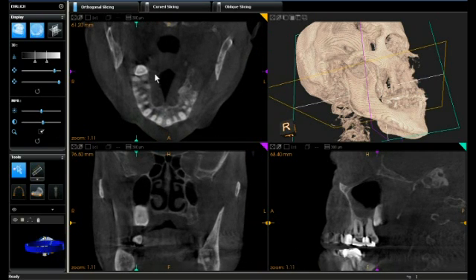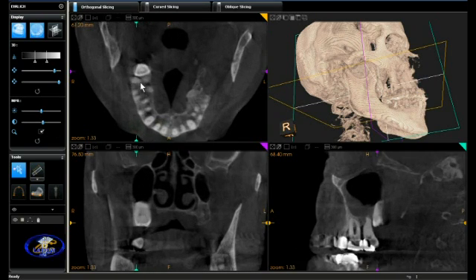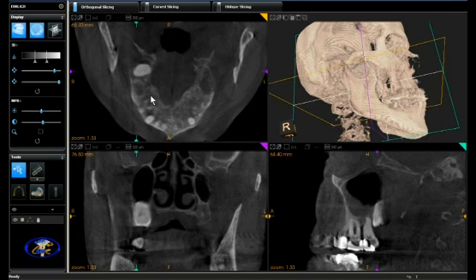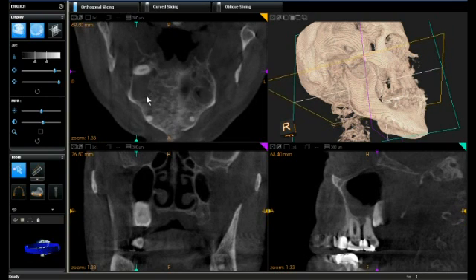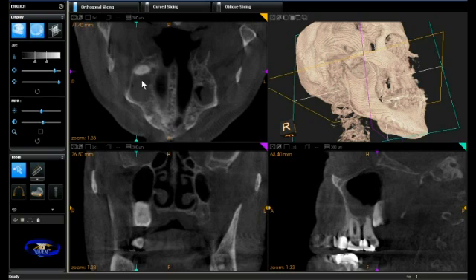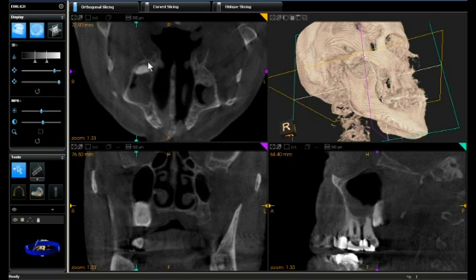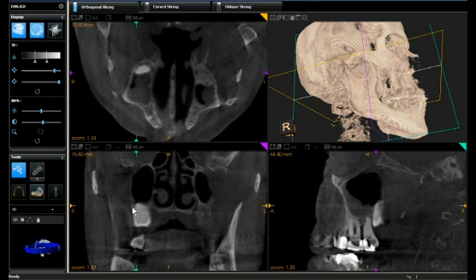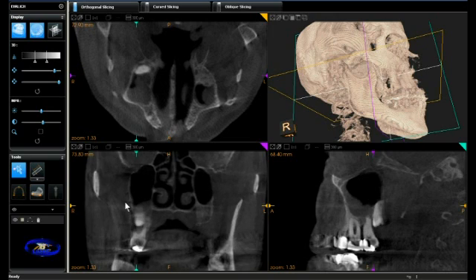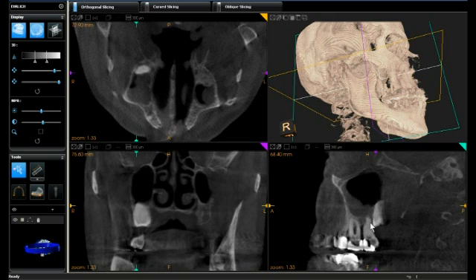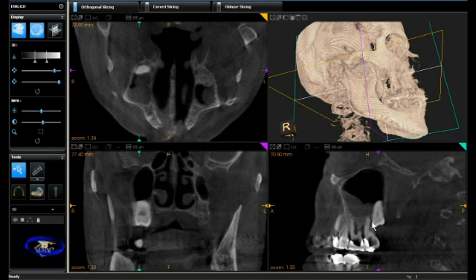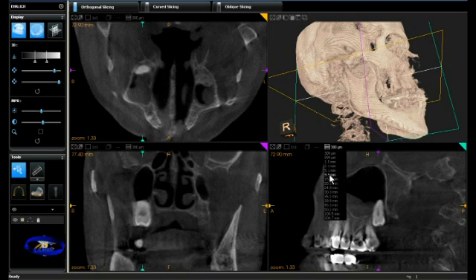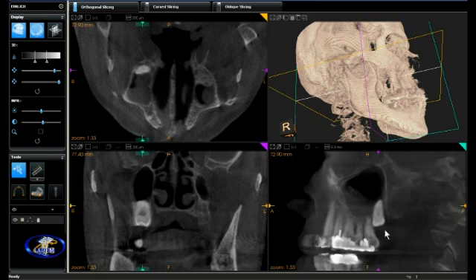We are able to see the third molar in the axial view with a slice thickness of 300 microns, and how it relates to the maxilla. In the lower left panel we can see the coronal projection and how that third molar relates to the sinus. On the lower right we are able to see it in the sagittal view.